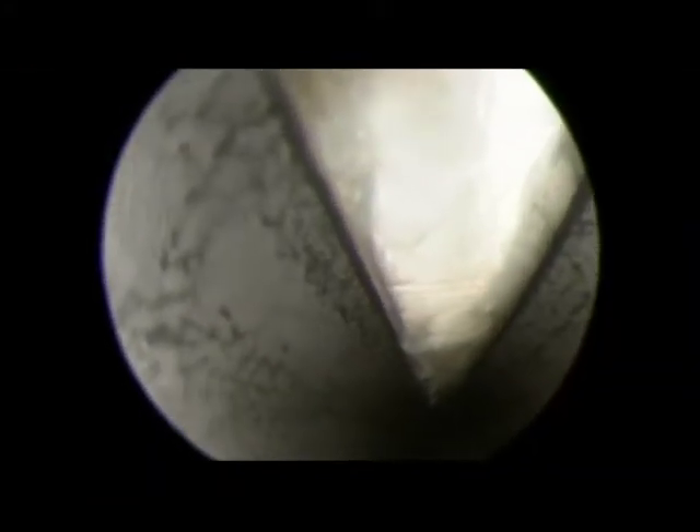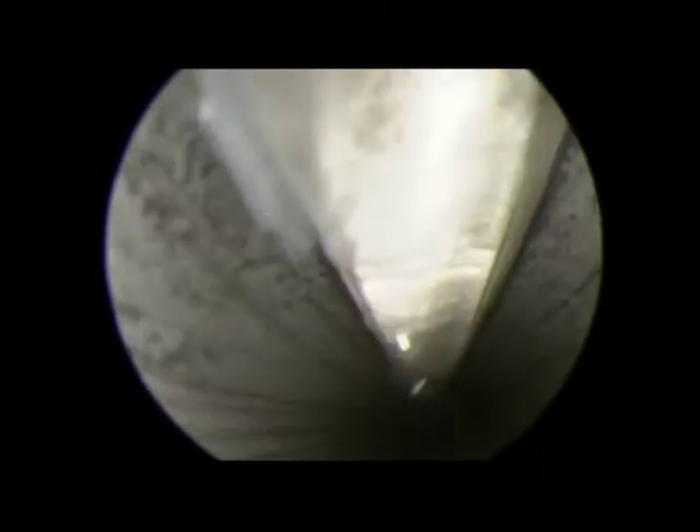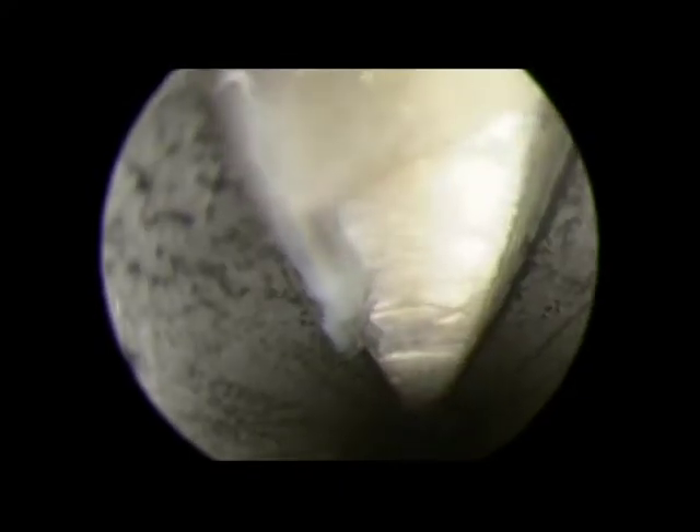A camera is introduced from the medial portal. The gastrocnemius fascia is then demonstrated from medial to lateral direction. The gastrocnemius fascia can be observed by moving the ankle up and down.